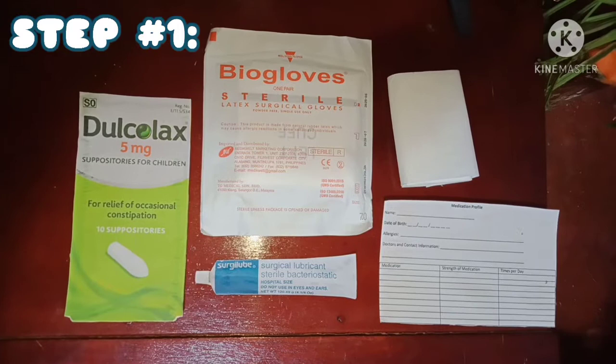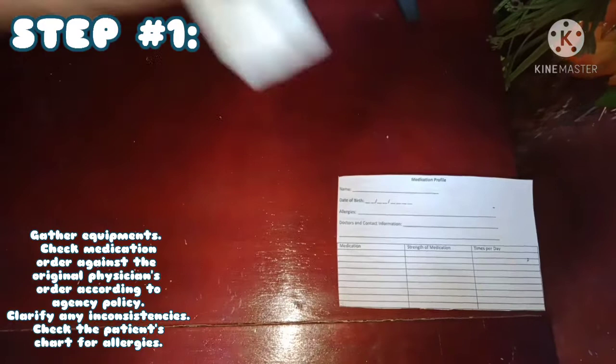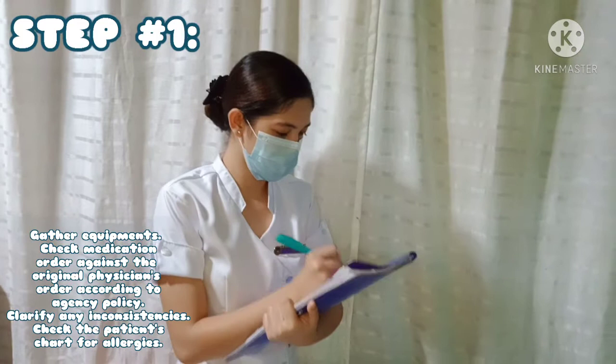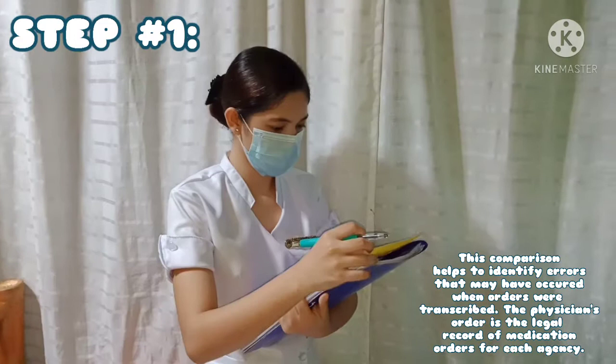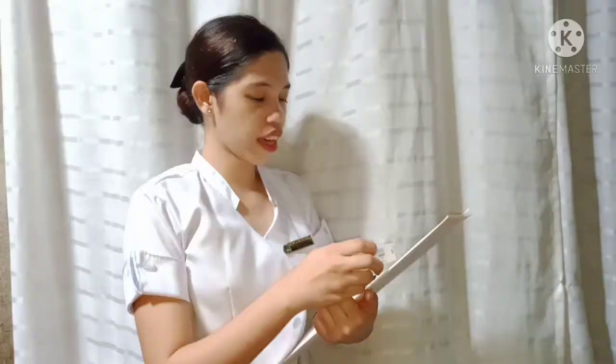Step number one: gather equipment. Check the medication order against the original physician's order according to agency policy. Clarify any inconsistencies and check the patient's chart for allergies. Comparison helps to identify errors that may have occurred when orders were transcribed. The physician's order is the legal record of medication orders for each agency.